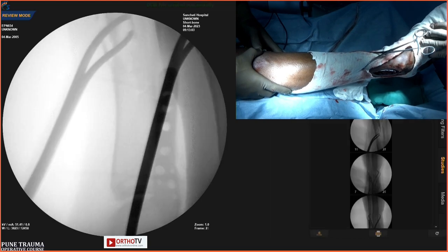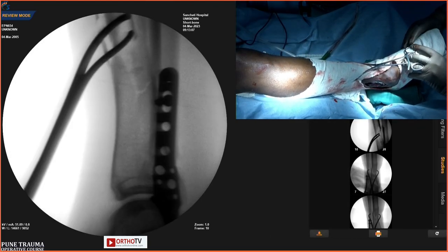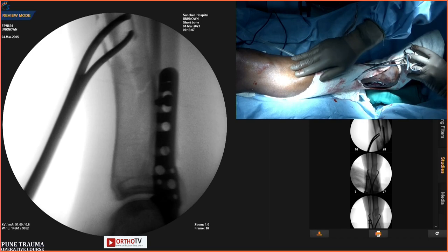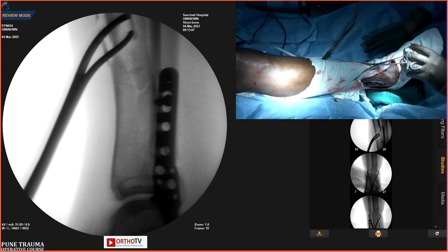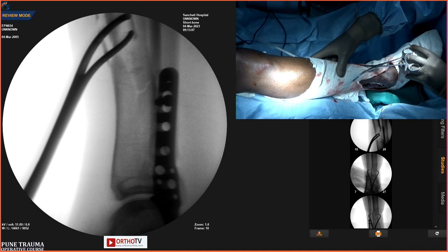Chetan, when are you starting the tibia? So we are about to start now. Okay. Gadegone sir has changed the plan to a suprapatellar nail. Okay, over to you. He wants to demonstrate a suprapatellar entry and approach for a distal tibial fracture. So initially we had kept a standard tibial interlock.